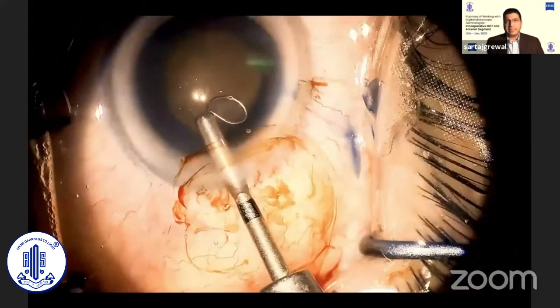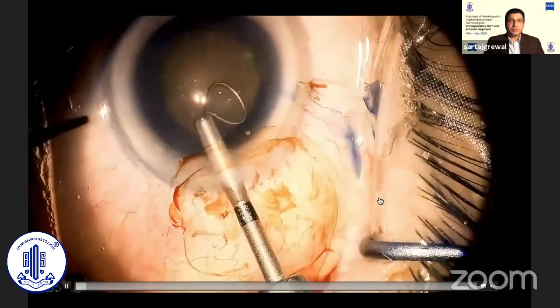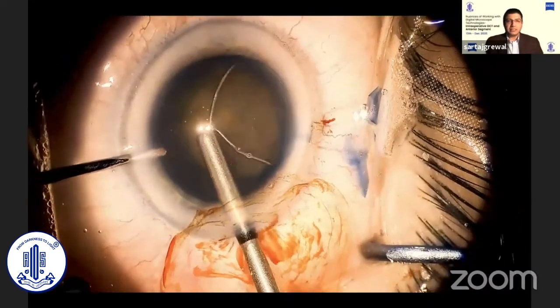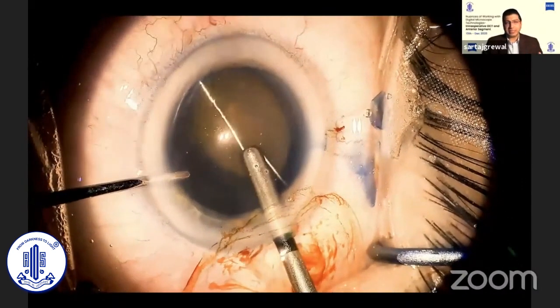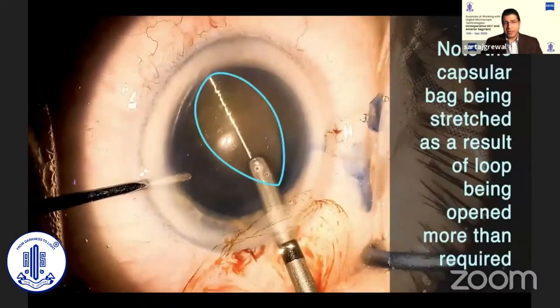I tried to expand the loop a little further, and immediately you can see the nucleus moving and comfortably resting in the center of the loop. Learning from my mistake, in the very next case I compensated by expanding the loop completely. This allowed the loop to easily slide around the nucleus and engage it. But the oval expansion put stress on the capsule margin and stretched it to an oval shape, as can be seen in this video. So it is a bit of an art to monitor this and make sure that you're not opening it too much.